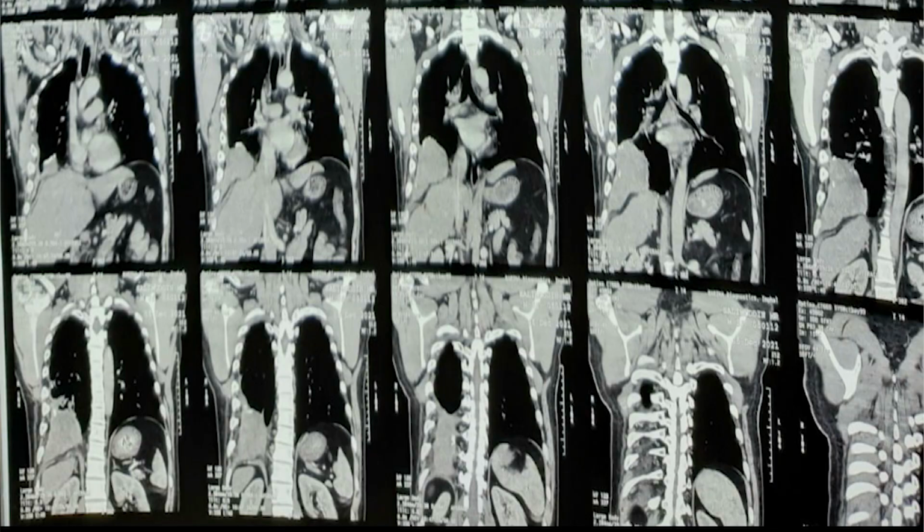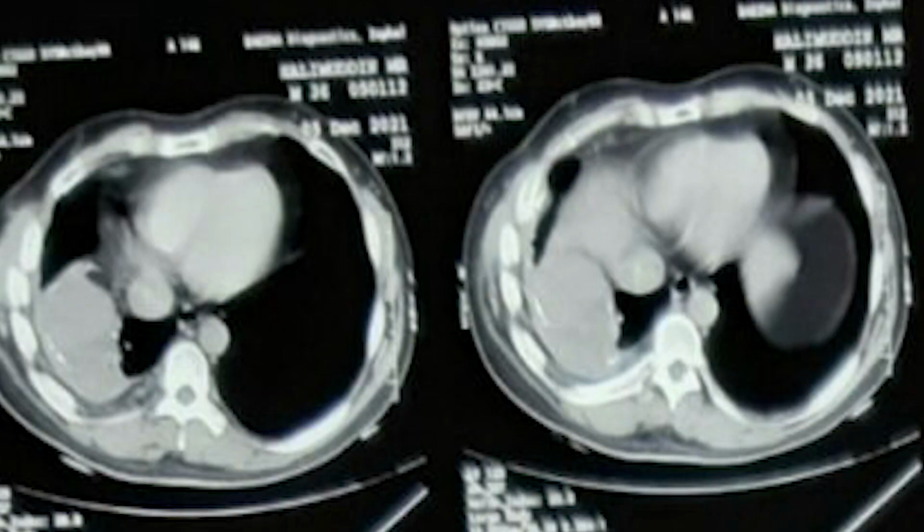Another interesting case was referred to us which had a huge aneurysm-type swelling in the right lower lobe. On pulmonary angiogram, we saw that blood was collecting, but we were not able to localize where it was coming from, though we could see a few feeding vessels. When we opened up through video-assisted surgery, we tried to aspirate it. We aspirated 20 ml, and again it filled up. We aspirated another 20, and again it filled up. It was not possible to go around it because it was huge, almost a little smaller than a football.